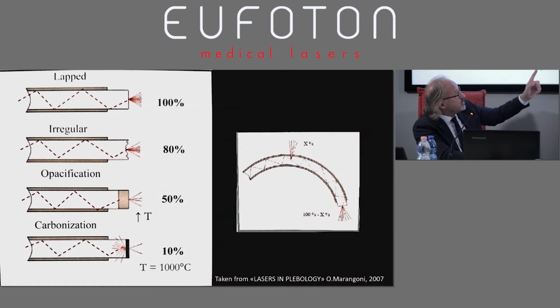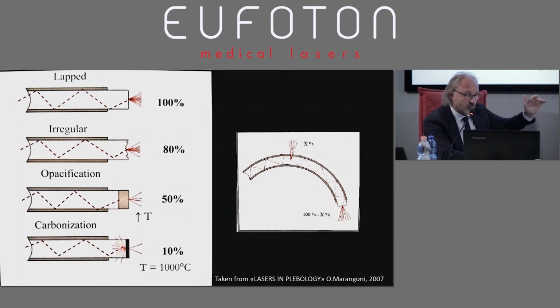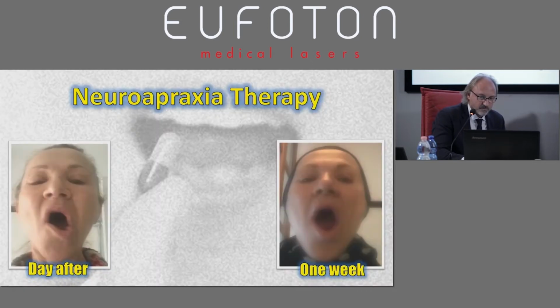And now you see the right image, the possible breakage of the fiber or discontinuity of the fiber. You see this because when you just connect the fiber, you see some dots of light on the path, even though it's nice looking and also suggestive. So there is energy dispersal, so the fiber is not compact. You test it once again, but if you see these fibers with some light dots, it's not a continuous fiber, so you have to substitute the fiber right away.